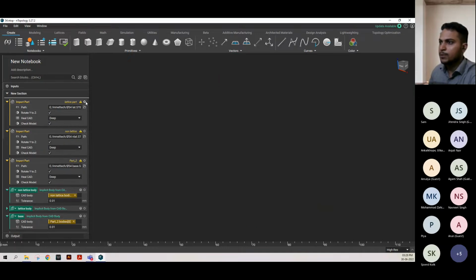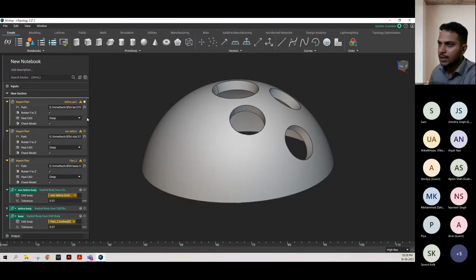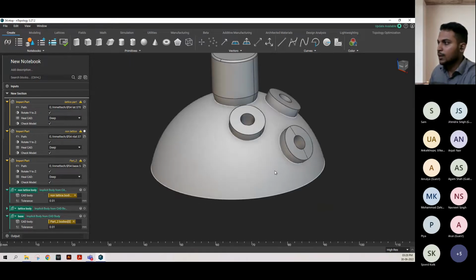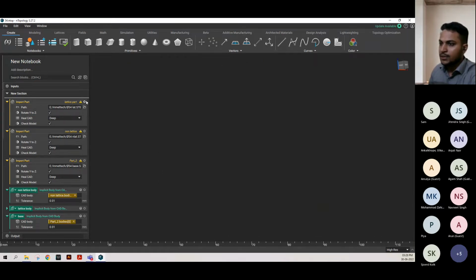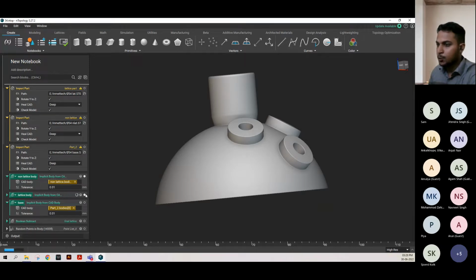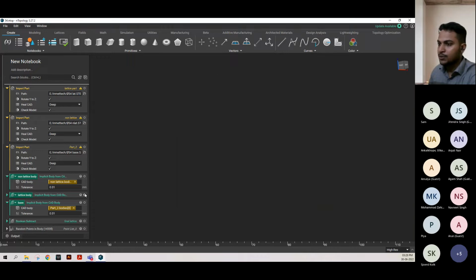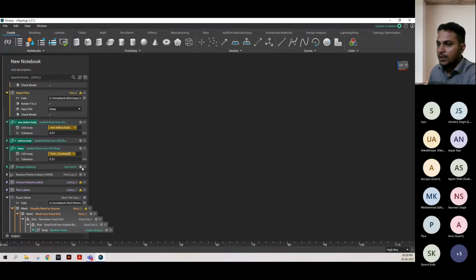It's just simple where we import the part, like normally I constructed this structure. This is the lattice part on which I need to have lattice. This is the non-lattice part on which I don't need to have a lattice. Okay. So I just segregated my body and I converted everything into a lattice, an implicit modeling structure, which is available in nTopology.